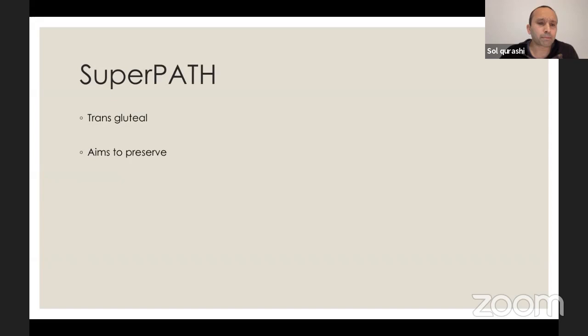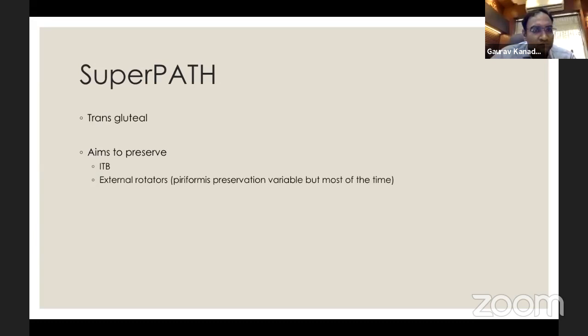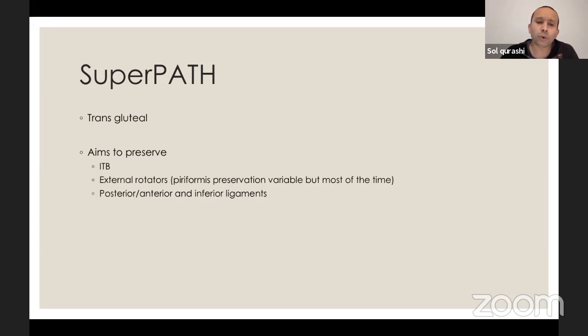And it aims to preserve the ITB. We don't touch the ITB. We don't touch the external rotators. You know, piriformis may get a bit of a tear or might stretch a little bit, and sometimes you might decide to release it and repair it. It will preserve all the other posterior external rotators. It'll preserve all the inferior, anterior, and posterior ligament. In the last 1,000 hips, zero times have I had to do an anterior release or an anterior capsulectomy or capsulotomy. I don't know why.